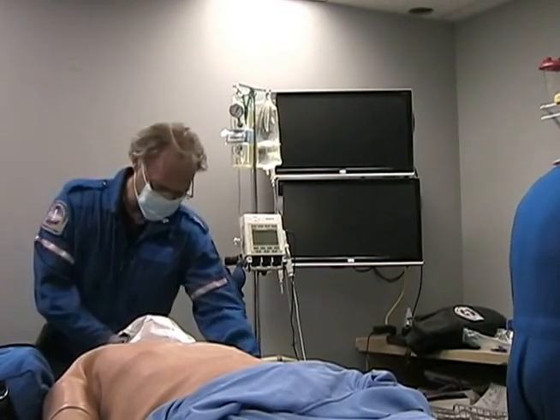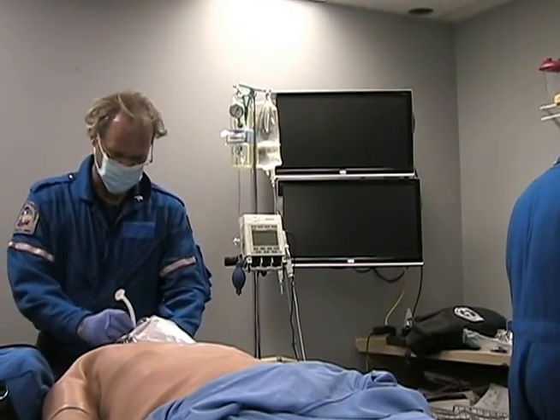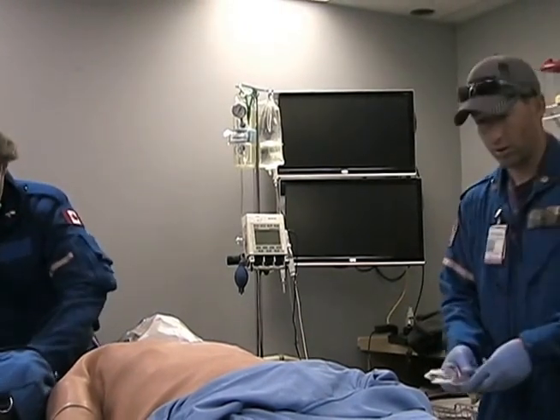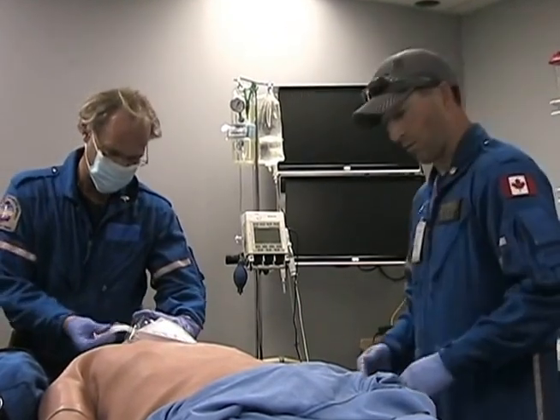You said he still has snoring respirations? Still has snoring respirations, yeah. Okay, will he accept these NPAs? He does. Okay, so I'm going to put those NPAs in. That seems to quiet down the snoring. If I go to put in the OPA, will he gag? No, he does not gag with the OPA, accepts it quite nicely. Okay, so I'll end up putting the OPA in as well.